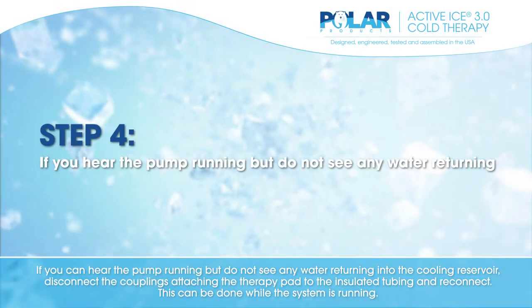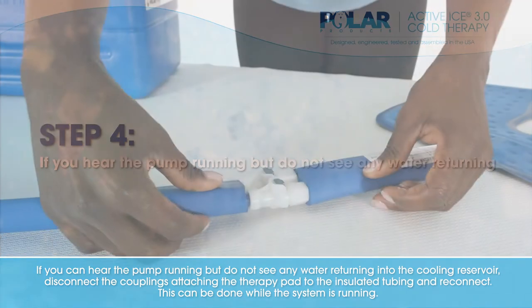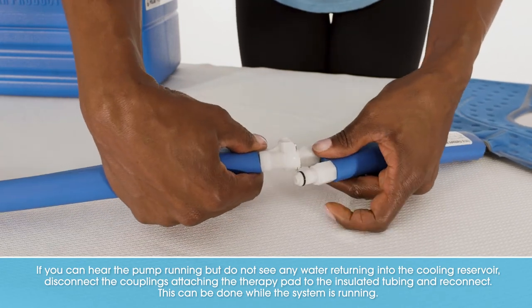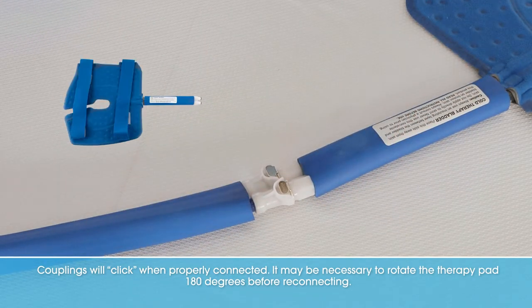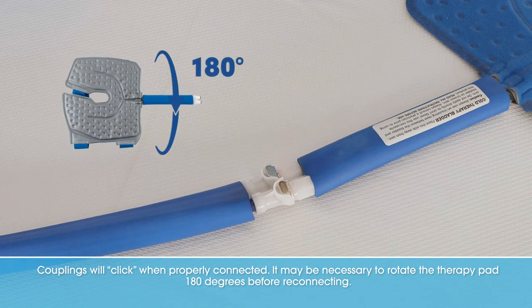If you can hear the pump running but do not see any water returning into the cooling reservoir, disconnect the couplings attaching the therapy pad to the insulated tubing and reconnect. This can be done while the system is running. Couplings will click when properly connected. It may be necessary to rotate the therapy pad 180 degrees before reconnecting.